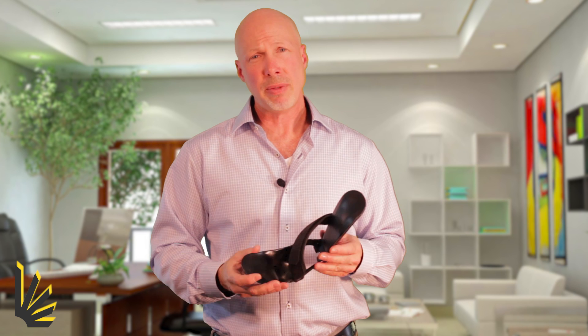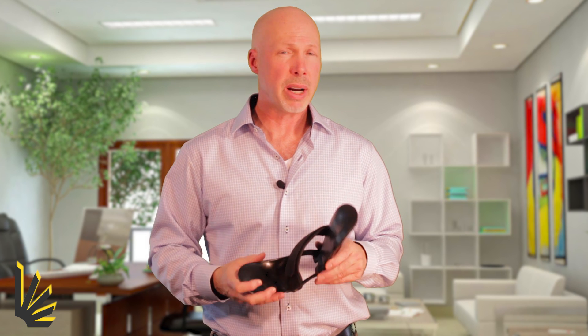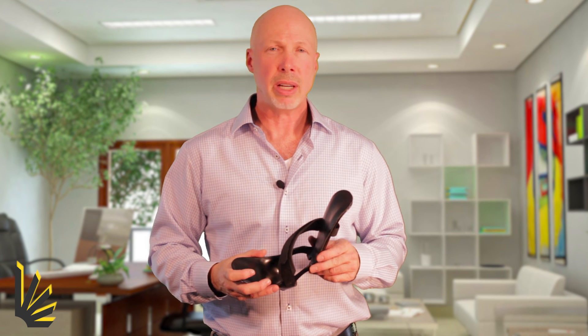The StepSmart brace is offered at a seven-day trial period, so you can see how it works for you. It's made right here in the United States in the state of Maine, and we think you'll be glad you gave it a try.